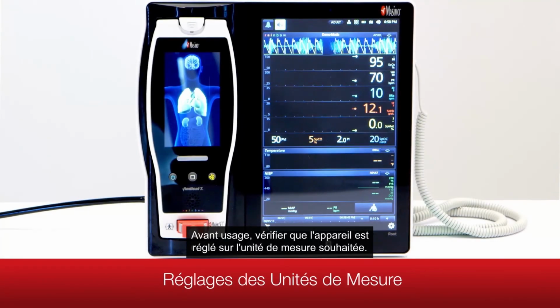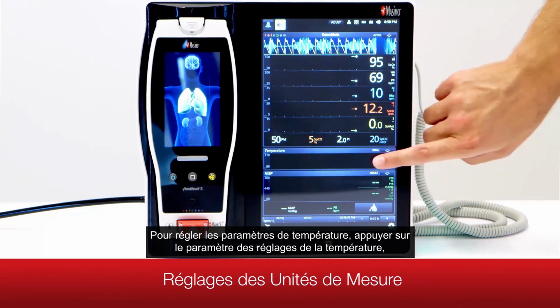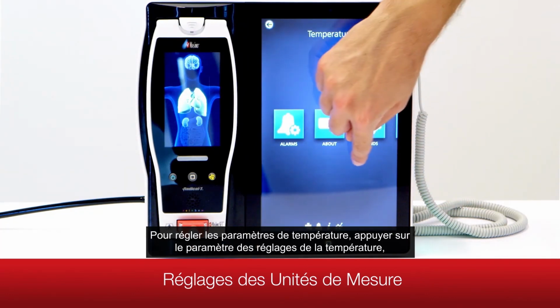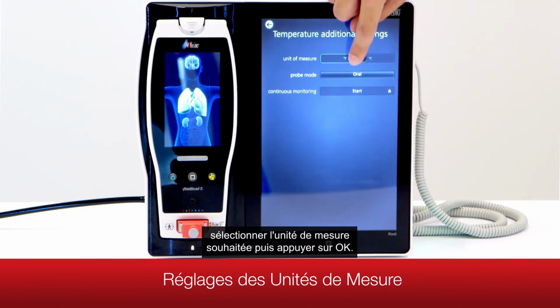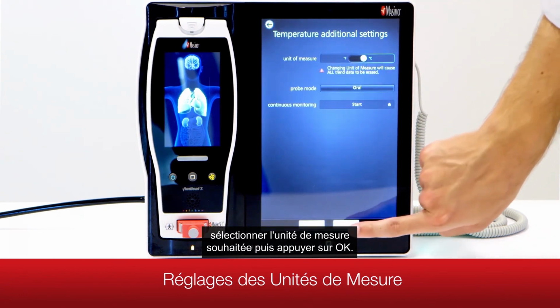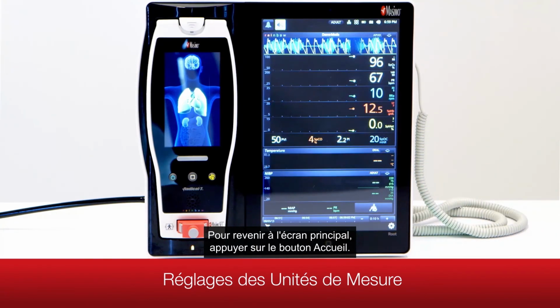Before operation, ensure the device is set to the desired unit of measure. To adjust temperature settings, touch the parameter from the temperature settings, select additional settings, select the desired unit of measure, and then touch OK. To return to the main screen, press the Home button.